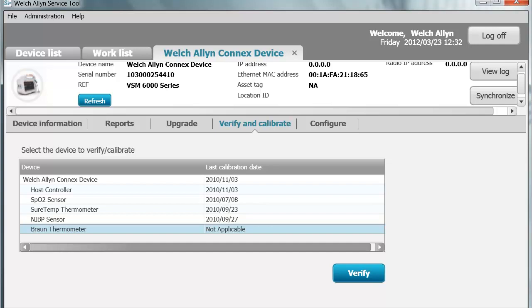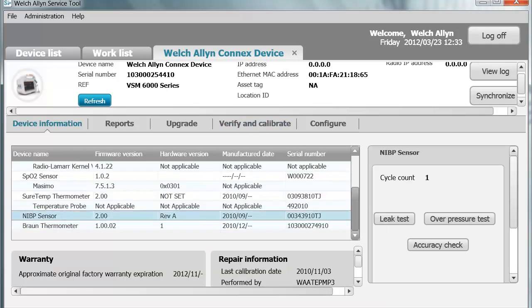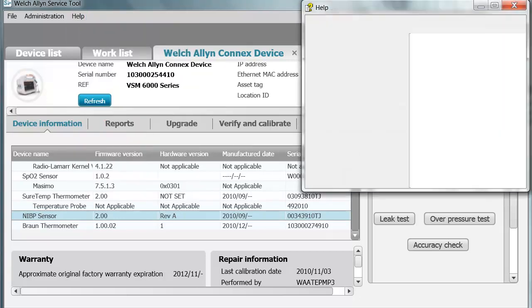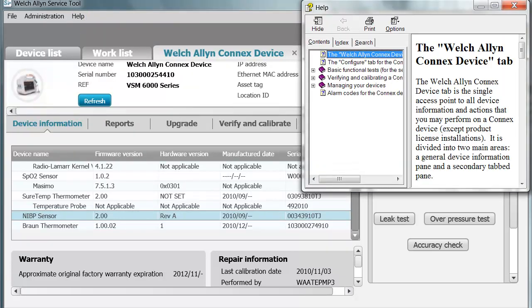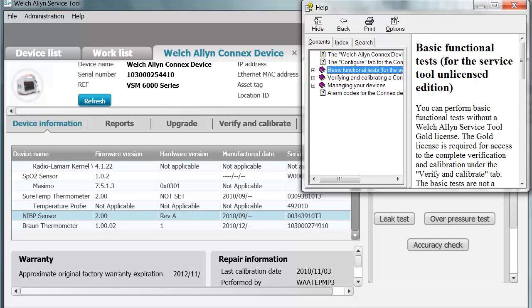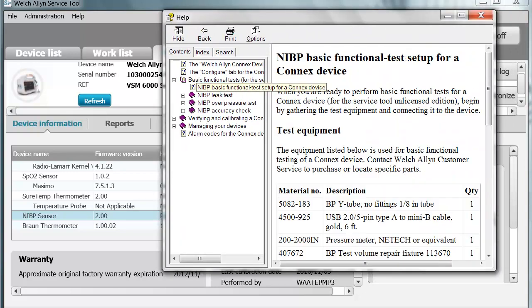Now let's perform a basic calibration check. A calibration check is device-specific or facility-specific. If your facility only requires you to check the accuracy of the device, go back to the Device Information tab, click on the NIBP sensor, and on the right you can perform a leak test, an overpressure test, and an accuracy test. Click on Help and select Welch Allen Connects Device — the detailed help file opens. Go to Basic Functional Tests for the Service Tool, Unlicensed Edition, which is the basic Silver edition. Click on NIBP Basic Functional Test Setup for the device.